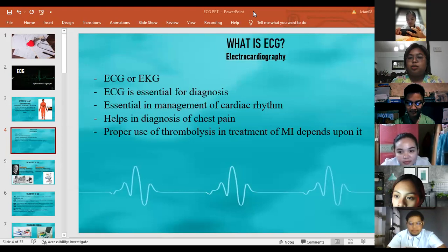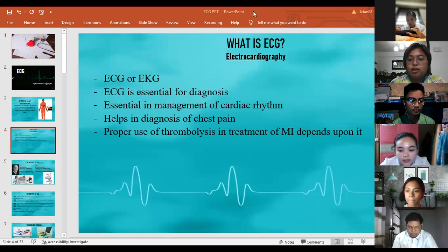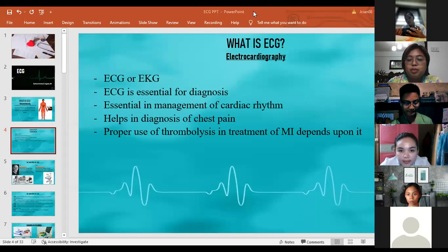Pagtiyagaan muna natin sa virtual. So for example, si patient ay pumunta ng ER, nag-complain ng chest pain. Na-indicate niya na nare-relieve pag umiinom siya ng pain meds. So ni-refer kay doc. Si doc, hindi niya pa makomplete ang kanyang final diagnosis, kaya kailangan dumaan sa ECG para makita kung ano talaga ang cause ng chest pain. Baka mamaya nasobrahan lang sa kain, yung busog na umaabot hanggang chest. Madami kasing indication pag sinabi mong chest pain.